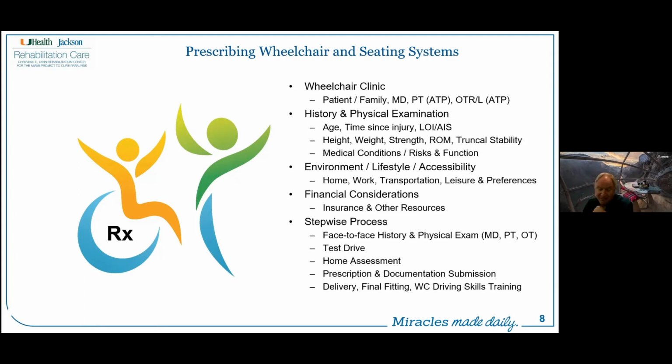And I've had this happen multiple times, but we shouldn't let that dissuade us from moving forward and trying to get the person what they truly need for modified independence. At the end, they have delivery of the chair and seating system with a final fitting with the therapists, and the assessment to make sure that they know how to use the wheelchair appropriately to keep them safe as well as others.